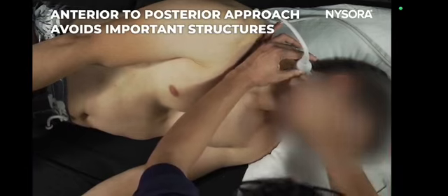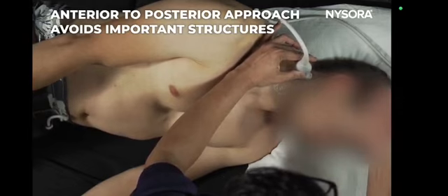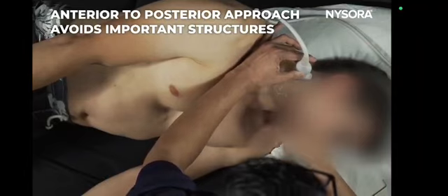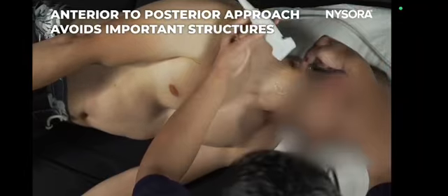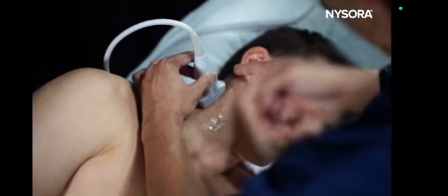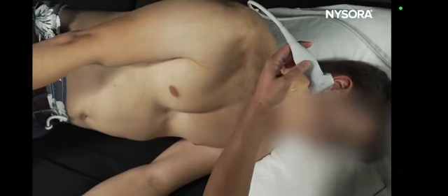and this is the way you would do an out-of-plane technique. When you want to do this injection, always remember the clinical pearl or the tip here is to try and do the injection, if out of plane, anterior to posterior. The reason to do the anterior-to-posterior injection is because you have all the important structures like the vertebral artery, cervical nerve root, and carotid artery, all situated anteriorly. So if you try and put the needle from posterior to anterior, you're heading towards all those vital structures. So it's always important to put the needle from anterior to posterior. So that's how you would perform cervical medial branch blocks.